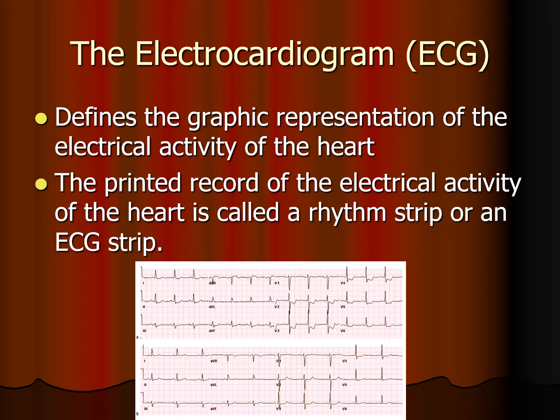I don't know if any of you have ever used those apps like Map My Walk or Map My Run, where you can see the path you took while you were on your walk or your run, any little detours you took, and the actual length of time you were on your walk. Well, that's what an ECG really is. It shows the path the electricity took through your heart, how long it took to get there, and the pattern of that, so the repetition of those beats.